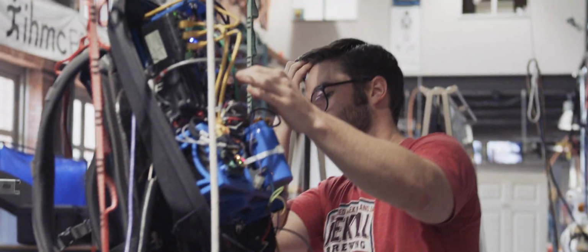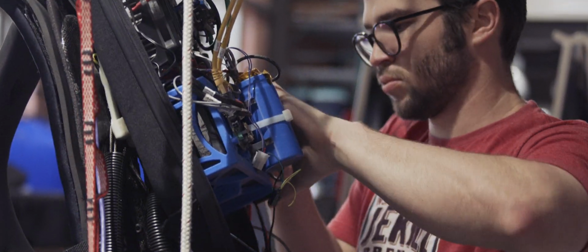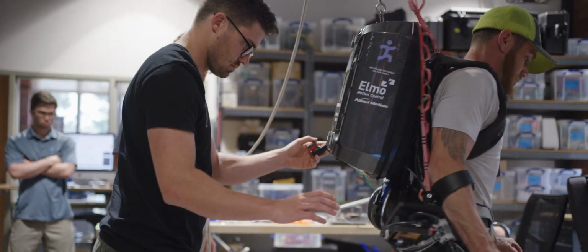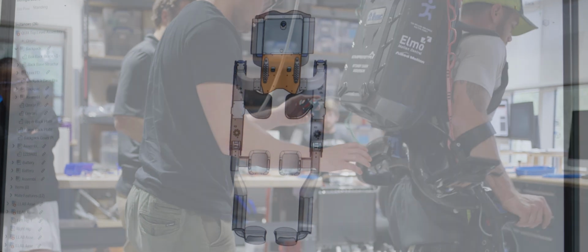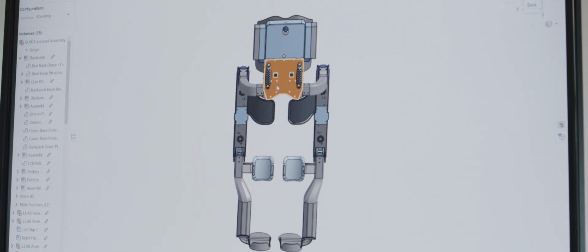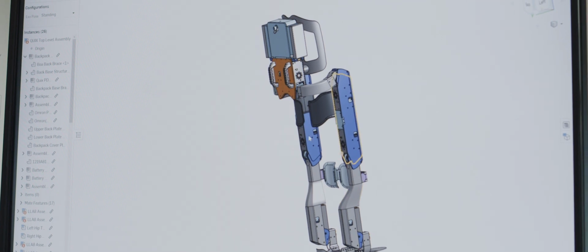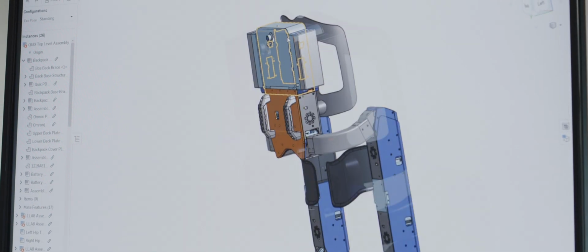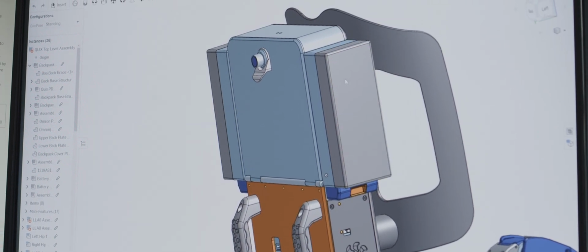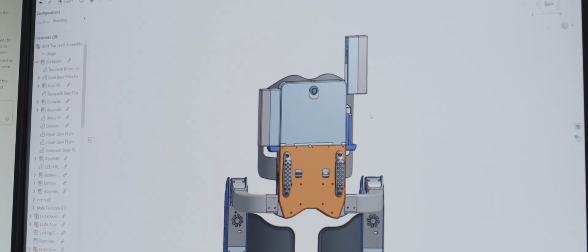So on the previous exoskeleton, we were kind of sloppy with how we did the computer and the whole backpack setup. There's a lot of excess space, excess wires. So on this iteration, we decided that we would make it a lot more compact, try and clean it all up and go about it a little bit more professionally. So Travis, our electrical engineer, has been working very closely with me to create these battery packs as well as an enclosure to house all of the electronics, computer boards, all of those things.